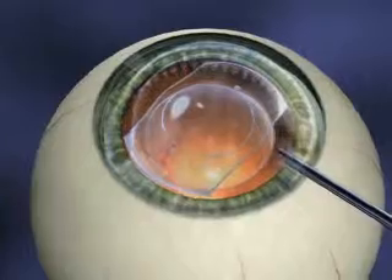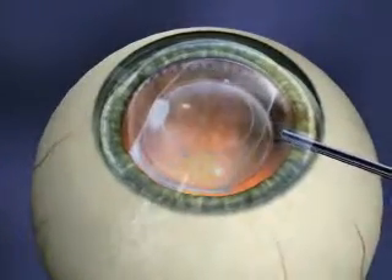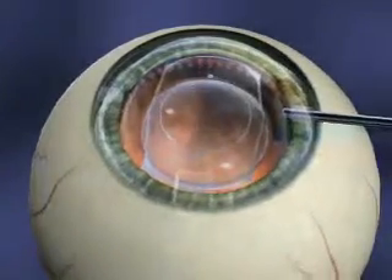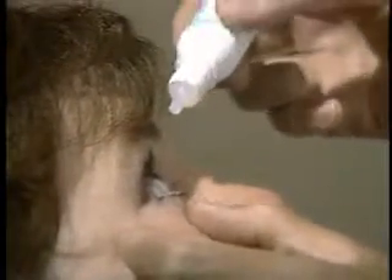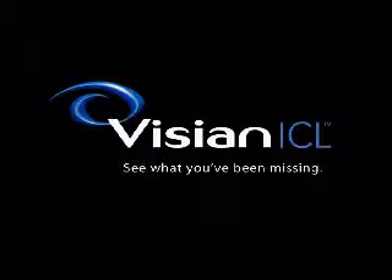Once the lens is in place, your surgeon will remove the gel-like substance. To complete the procedure, the surgeon will instill eye drops, which help prevent infection and inflammation. You will continue to use these drops for several days once you're home. With the completion of these steps, your Visian ICL will be comfortably and effectively in place.